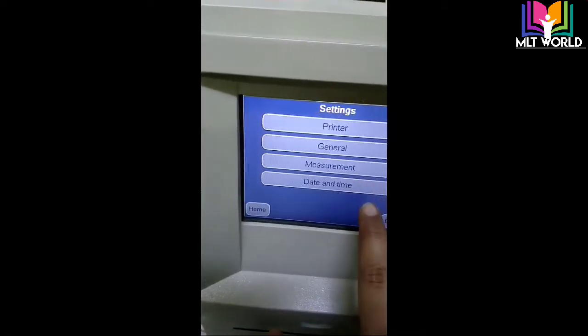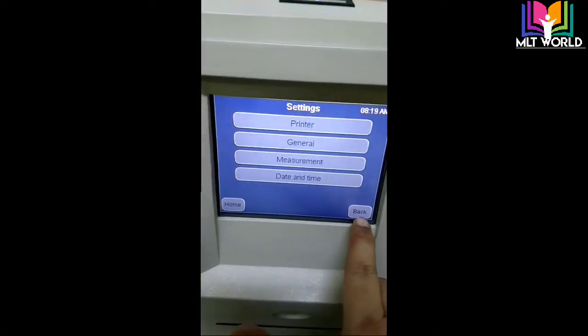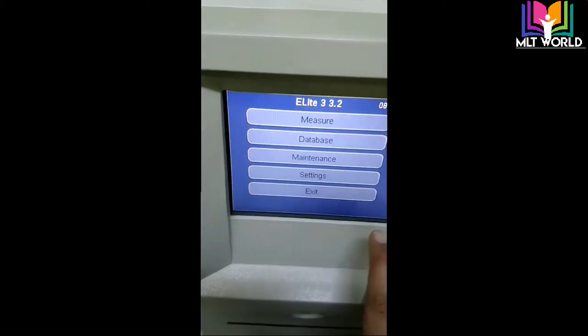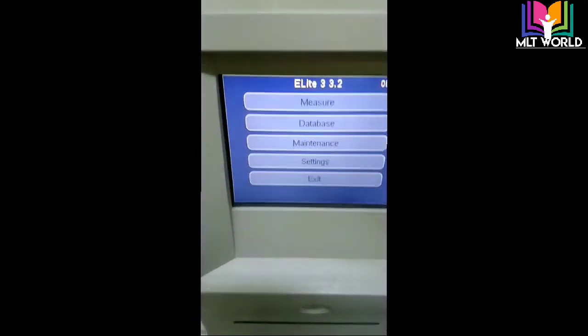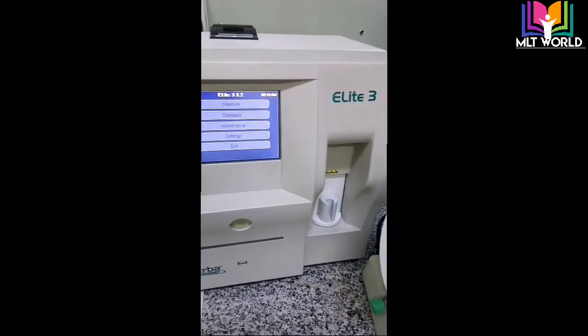In settings, there are options for printer, general settings, date and time, and measurement. We configure these settings as needed. When I click exit, it will go to the shutdown process.